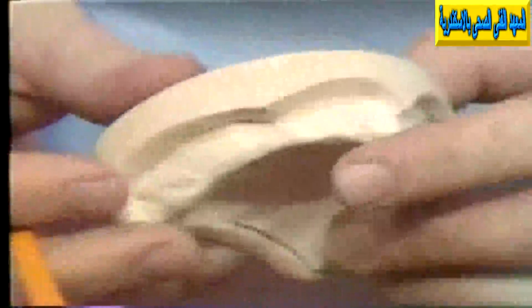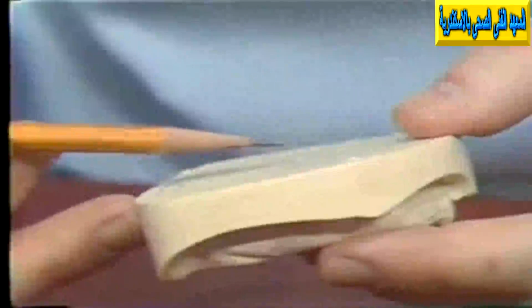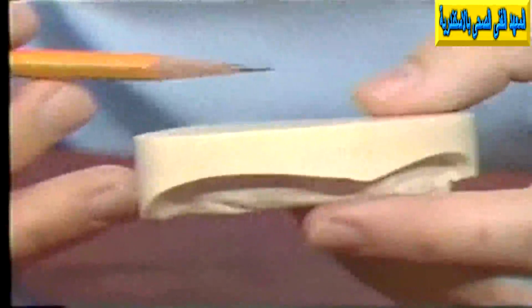If the master cast is too thick, number one, it will not fit in the articulator properly, and number two, it will not fit in the processing flask in which the denture bases are made. So there are reasons for having the base a certain thickness, and as a general rule, about 1/2 of an inch thick.